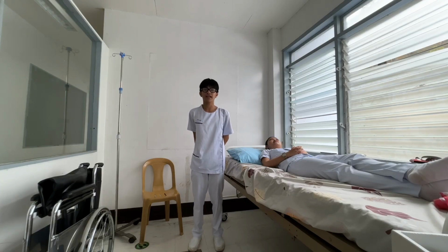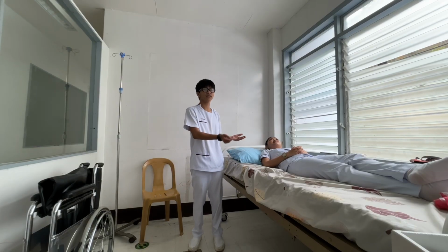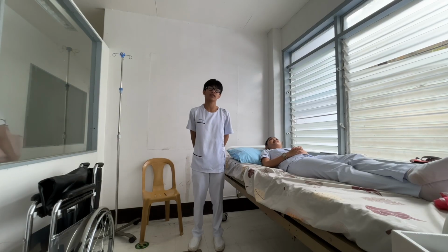For the definition, assisting a patient from bed to wheelchair is a safe, clinical, and caregiver-guided transfer technique involving pivoting, designed to move a patient from a lying to seated position, then into a wheelchair.